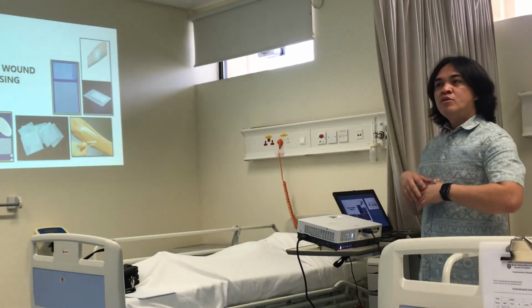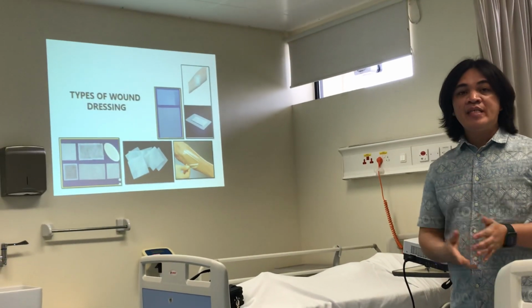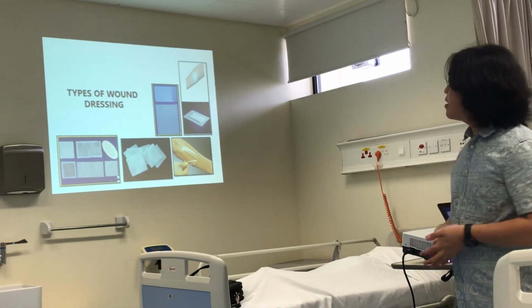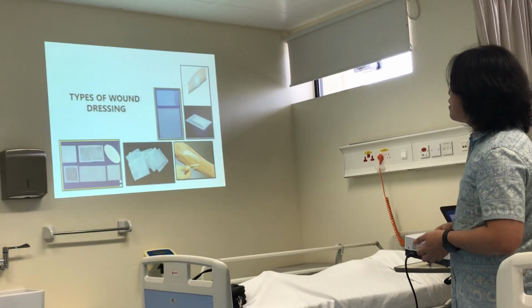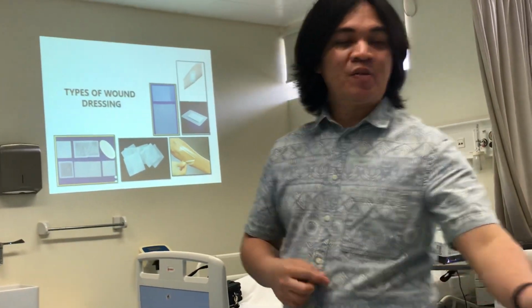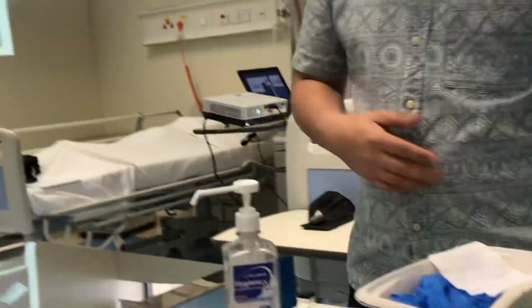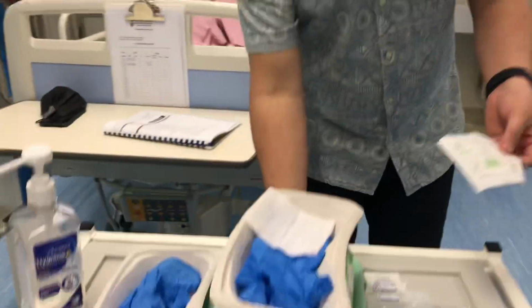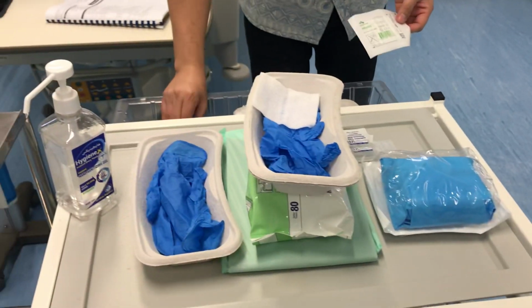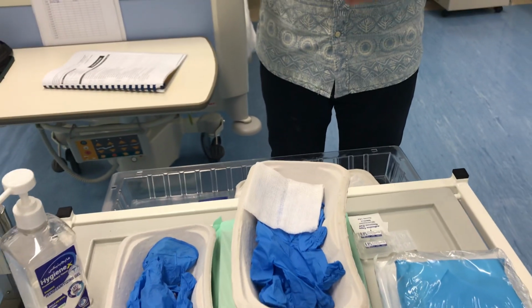Okay. Now, those are important terms. You need to tell them also the dressing material that we use in the hospitals. And commonly, the most common dressing that we have is the 4x4 gauze. The most common. And that is exactly what we have here. Or this one. You can show them this one also. We have different sizes. It depends on the wound size. Okay? This is mid-pore.